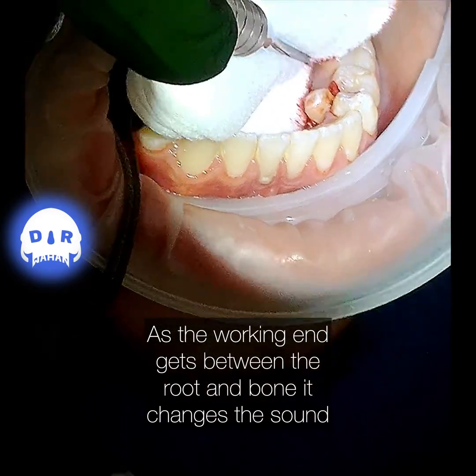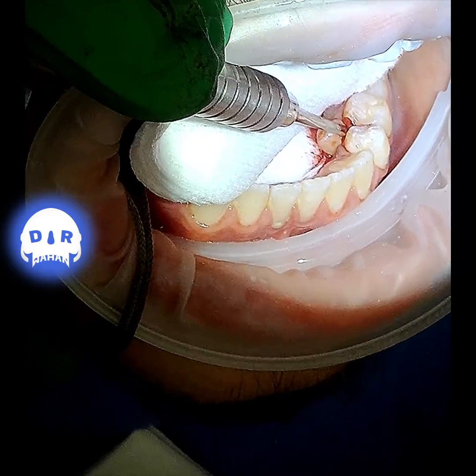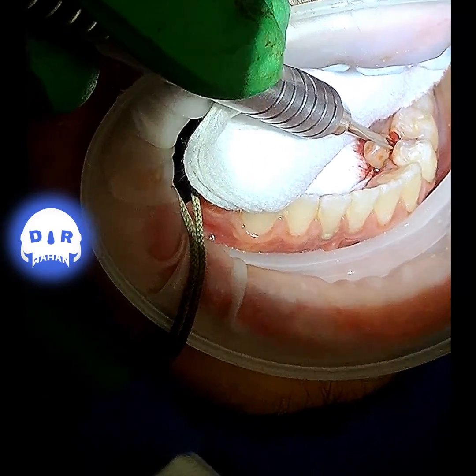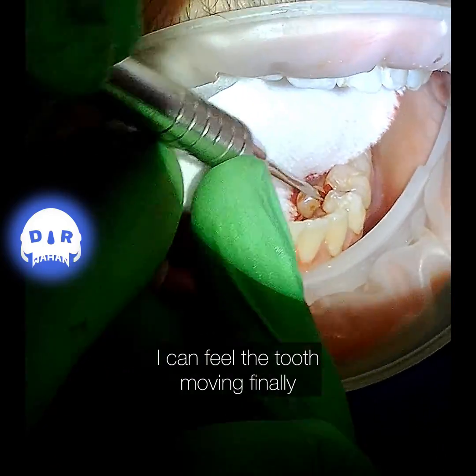Using a handpiece would require a bigger incision and flap, but this is working. The periotomes come in different shapes, sizes, and angles, so usually you can find one that can get into the area you need.